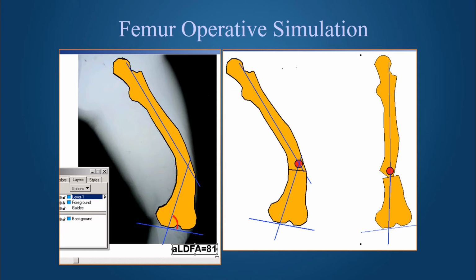We decided where we wanted to perform the osteotomy in order to get maximum stability and also take the minimum duration for healing of the osteotomy. Were we to perform an opening wedge correction in this patient, then we would get an opening wedge of a maximum extent of 4 to 5 centimeters in the concavity, which may have taken us as much as 5 to 7 months or even more for full consolidation.